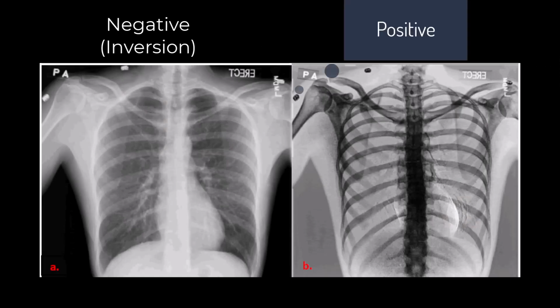On the right is the positive image that we've collected, and by inverting that, we get a radiograph that we're used to on the left. This completes the process of having a photon of energy interact with tissue to create a radiograph.